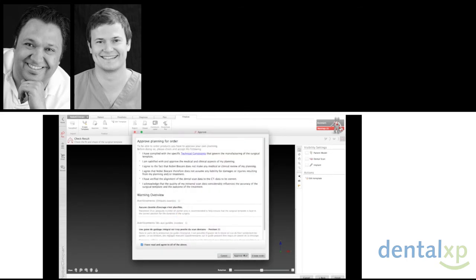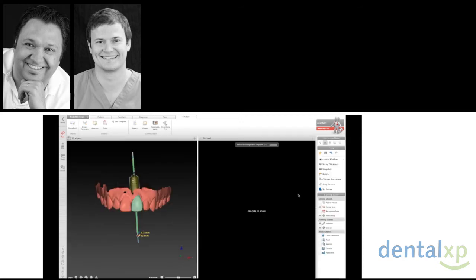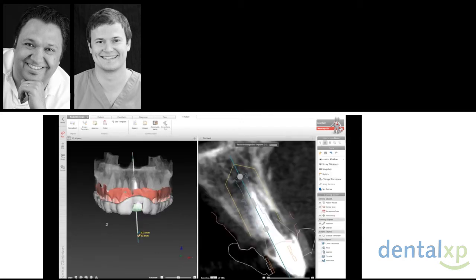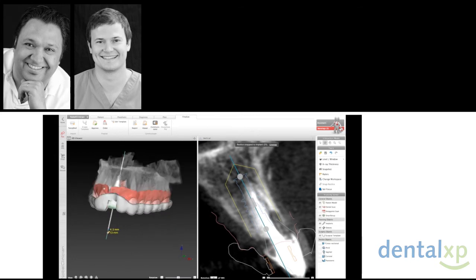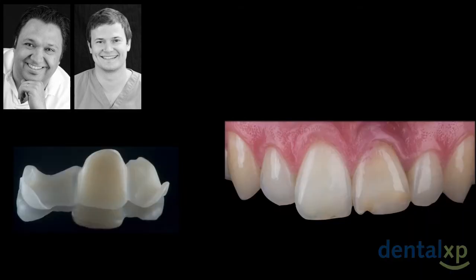And this is the surgical guide that we are going to obtain. And you can see here the planification. We will see that with the next case, but from this stage we can also ask the software to build for us what we call a temp shell. It is going to be a shell that we are going to reline to build a provisional on the same day. And this is what you can see here on the left side.